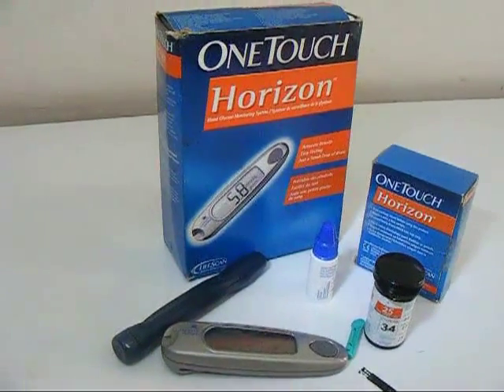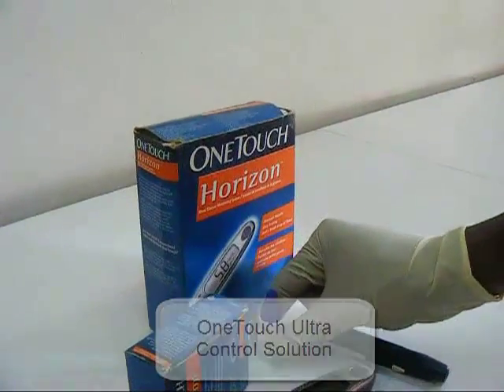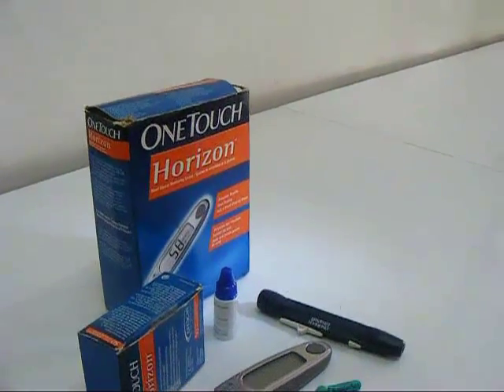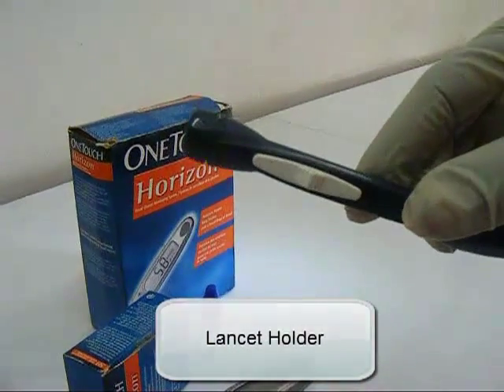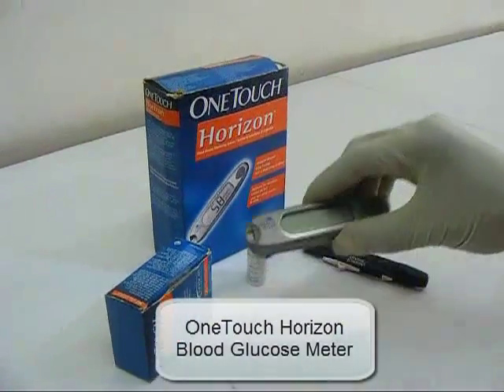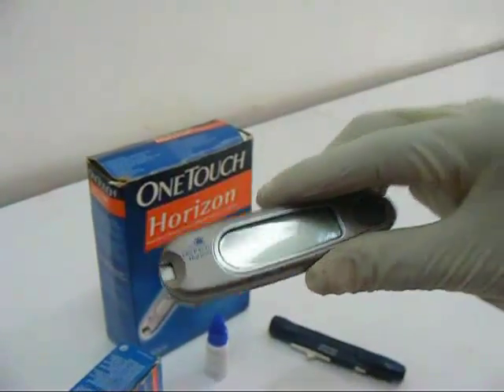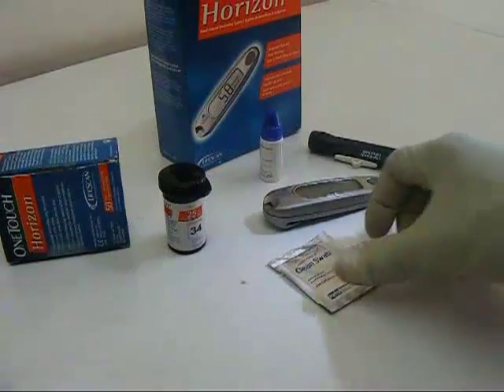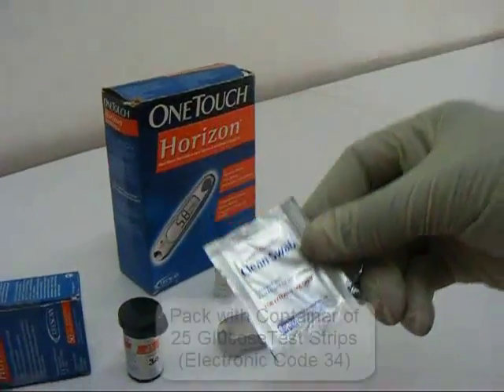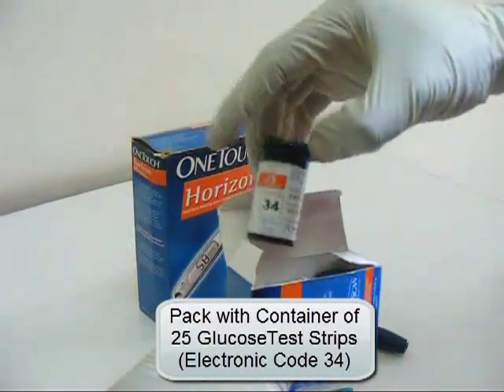The OneTouch glucose monitoring kit consists of a OneTouch Ultra control solution, a lancet, a lancet holder, a OneTouch Horizon blood glucose meter, a clean alcohol swab, and a pack which has a container with 25 glucose test strips of electronic code 34.